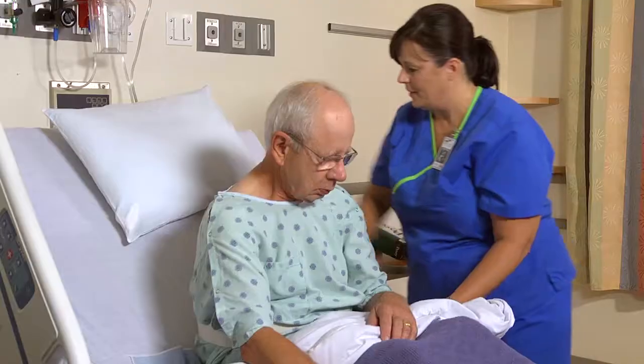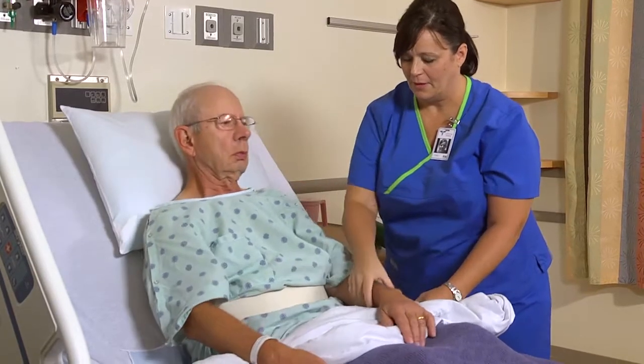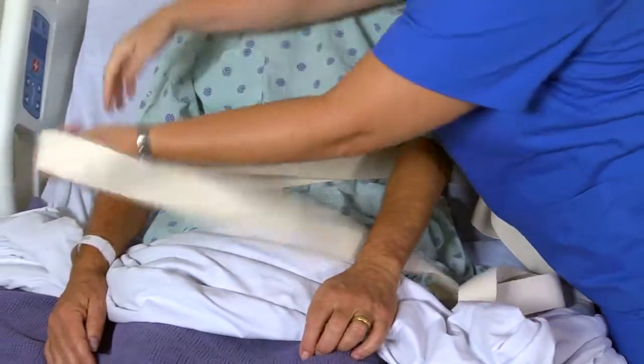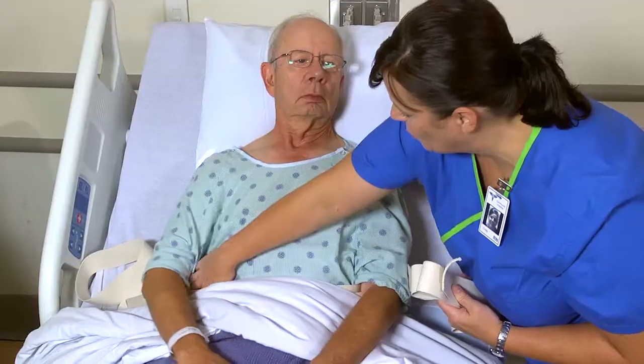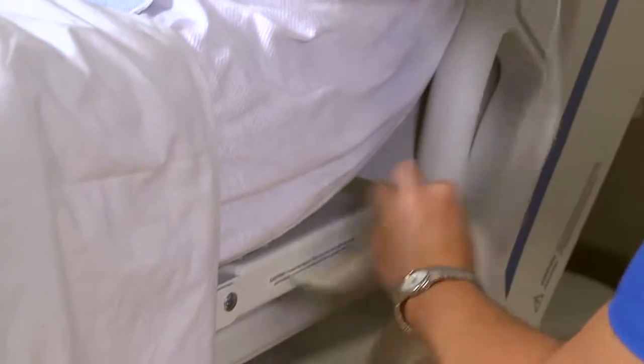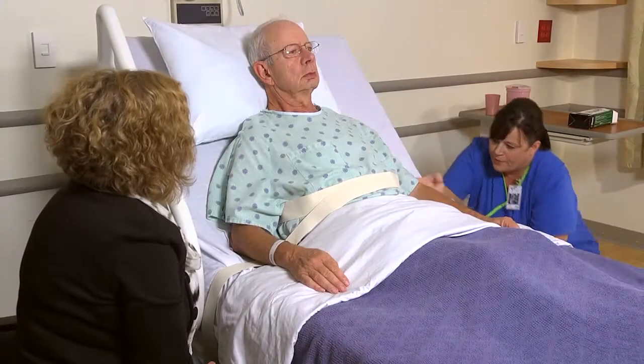Help the patient lie down and get as comfortable as possible. Ask the patient to take a deep breath to assure there is no restriction to his breathing. Attach the restraint securely to the stationary part of the bed frame. Before you leave the patient, make sure he knows where the call light is located.